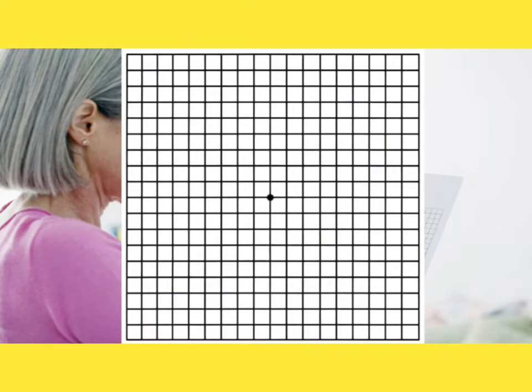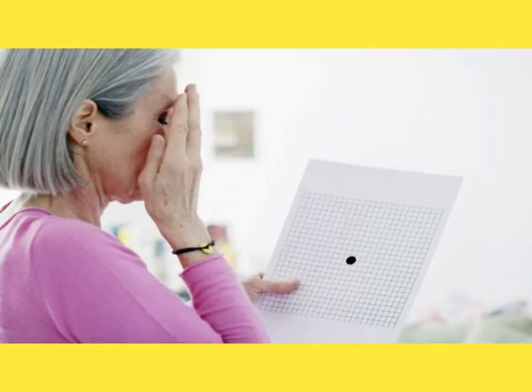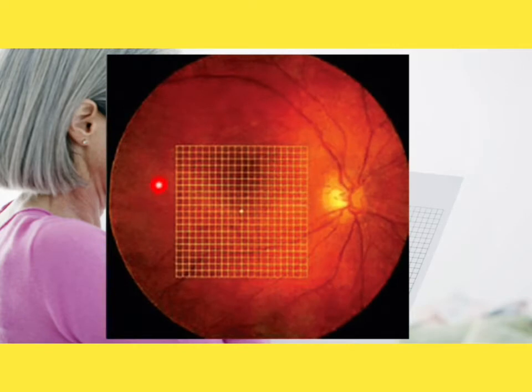Okay, so these cards look like this, and you can see in this fundus that this card is covering this area, which is the macular area. When the patient is holding this card at a specific distance, that I will discuss with you all in a later slide, then it will cover the central 20 degrees of the visual field.